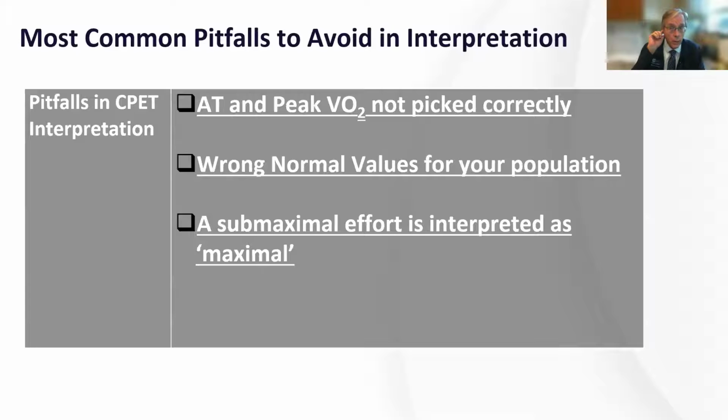So you also want to make sure that the technician writes down why they stopped at the end of exercise. I usually try to use a very open-ended question: at the end of exercise, why did you feel the need to stop? And then if they're not too descriptive with that, I'll get down into whether it was more breathing or legs or maybe orthopedic issues, et cetera, and document that so that later on you can dissect that. If you're not in the room, you want your technician to write more. If you're in the room, then you've got a good feeling for it.